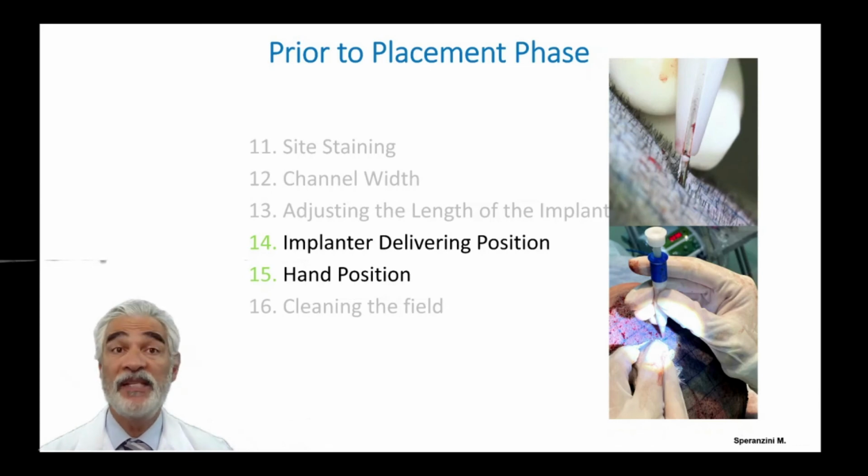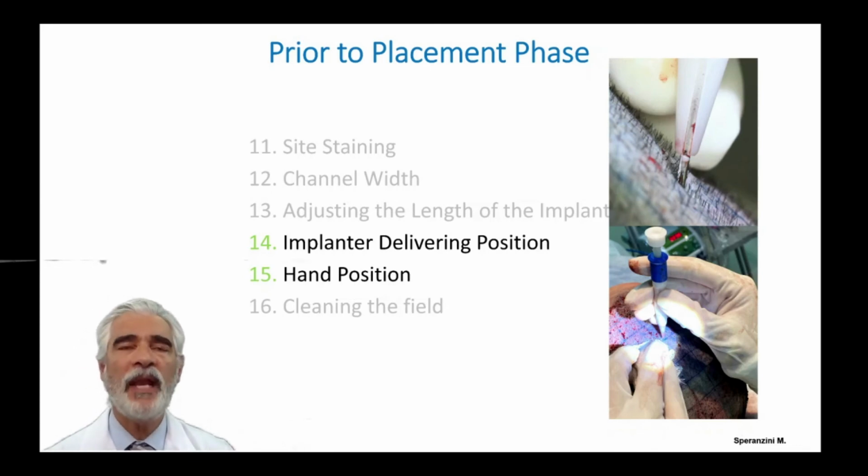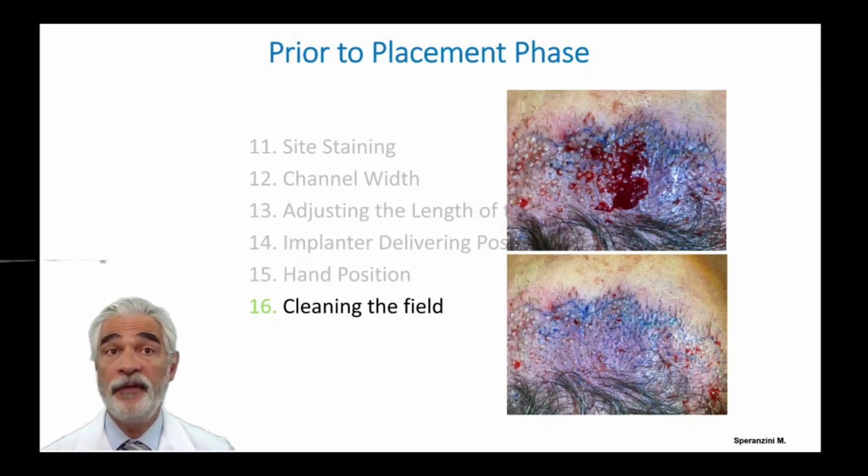The implanter must be delivered to the surgeon's hand with the bevel facing to the left, and it is rotated as described in the text. In this way, the hand movement is minimal. A clean field, free of ink or blood, is essential.